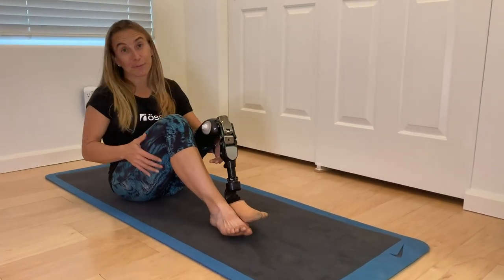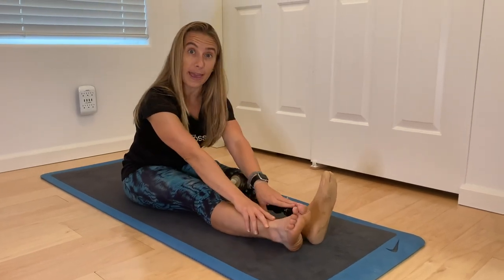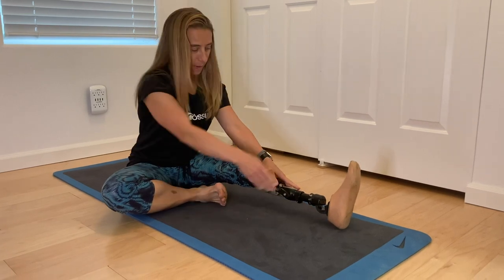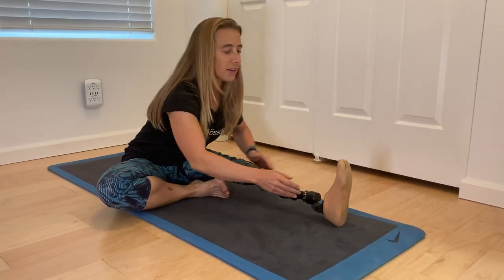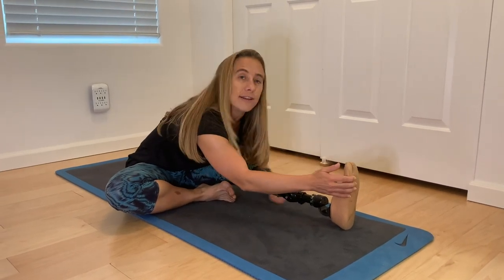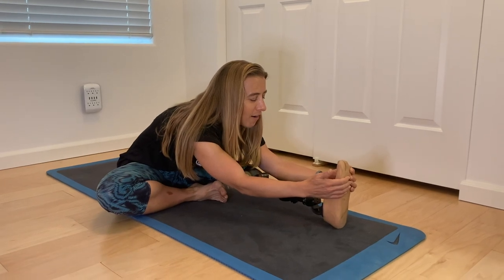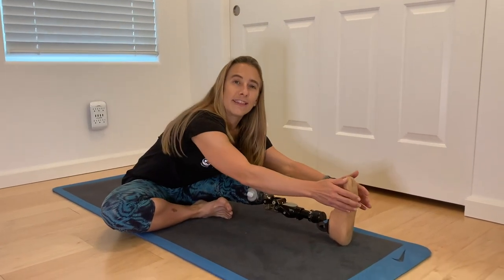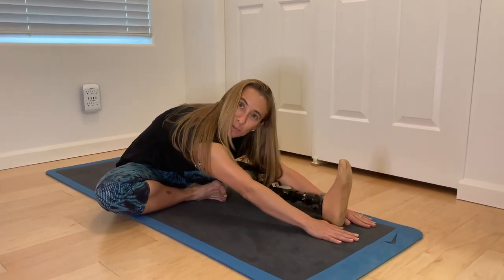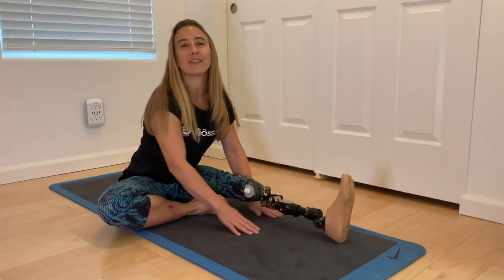I'm going to show you now a hamstring exercise. Let's stay on the ground and bring your feet out in front of you. Take one of your legs and bend your knee. Make a number 4. And we're going to stretch our hamstring. I'm going to start with my prosthetic side. Basically, if you can, try to grab your foot and lean forward and stretch that hamstring. Hold that stretch for 5 seconds. 1, 2, 3, 4, 5. And then relax a moment. Then engage again in that stretch. Try to reach a little further if you can. Stretch that hamstring one more time. 1, 2, 3, 4, 5. And release. I like to do this 3 to 5 times on this side.